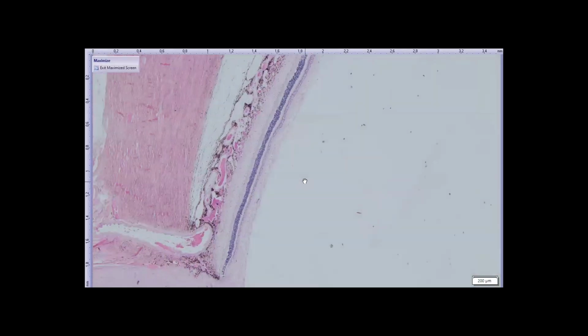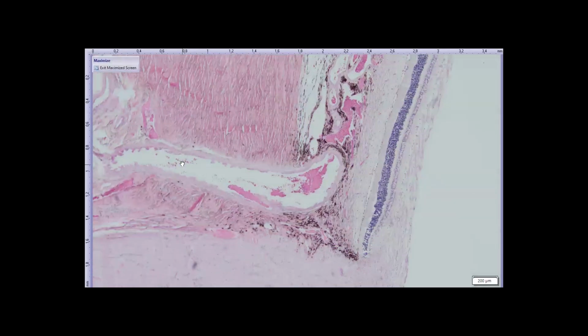So these are carnivores related to dogs, bears, etc. And you'd expect then would have again a tapetum that goes both in the front and the top and the bottom portion of the fundus. They have a cellular tapetum. It looks for all the world like a dog tapetum. And they too have a plexus of arteries adjacent to the optic nerve, but not as robust as the ones you'll find in the cetaceans.